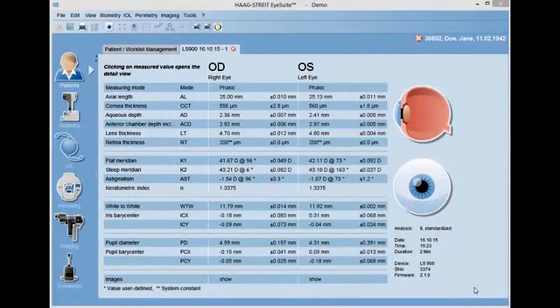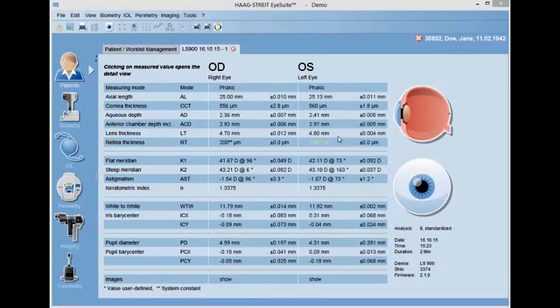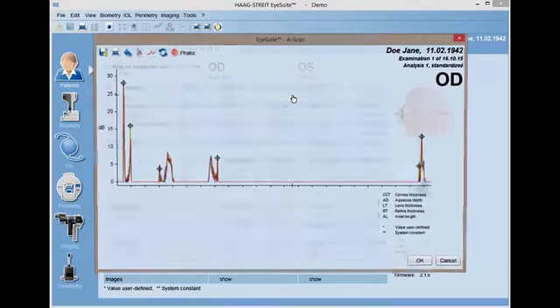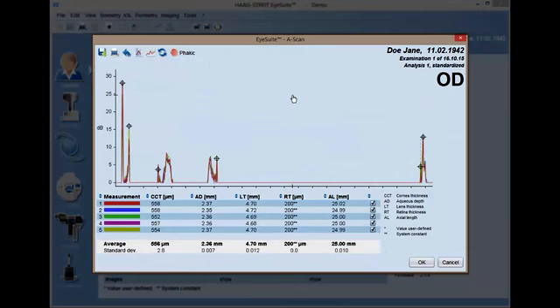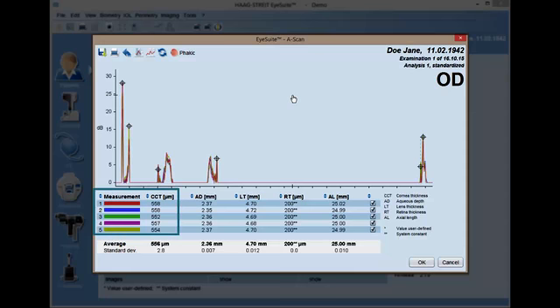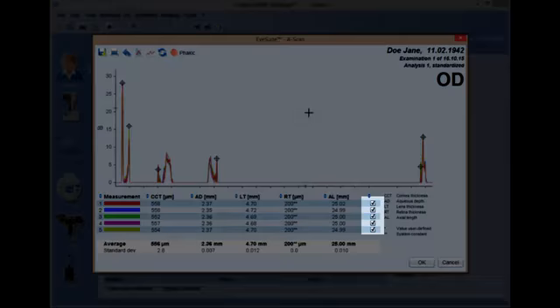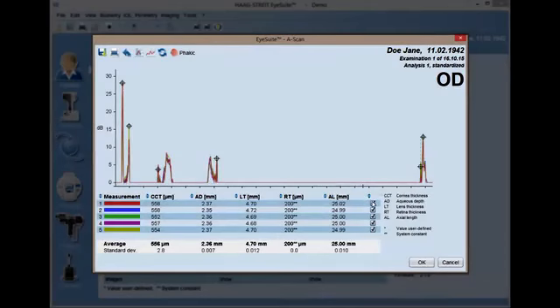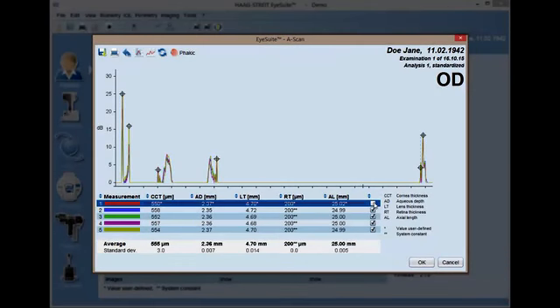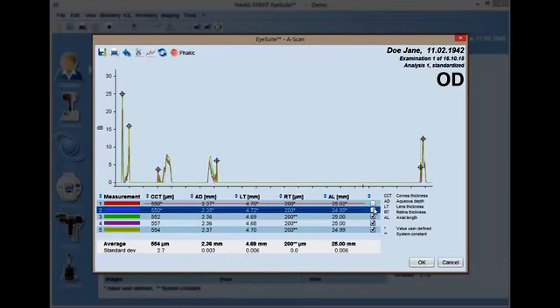By selecting any of the length measurement values, the user can open a new window displaying all of the individual length measurement values from the biometry acquisition. From this screen, the user may select individual measurements to evaluate independently. Measurement data can be excluded entirely by unchecking the box to the right of the measurements.